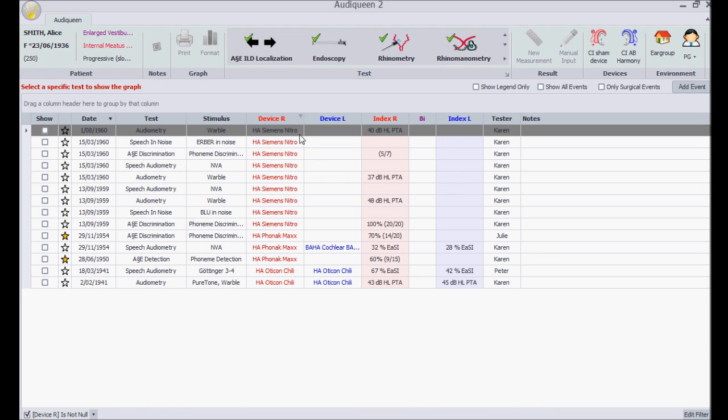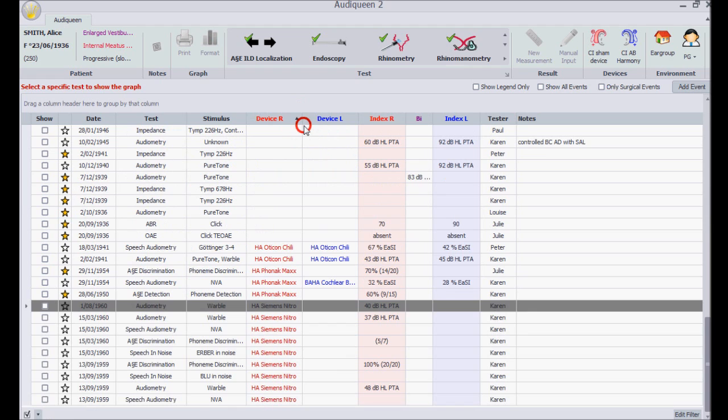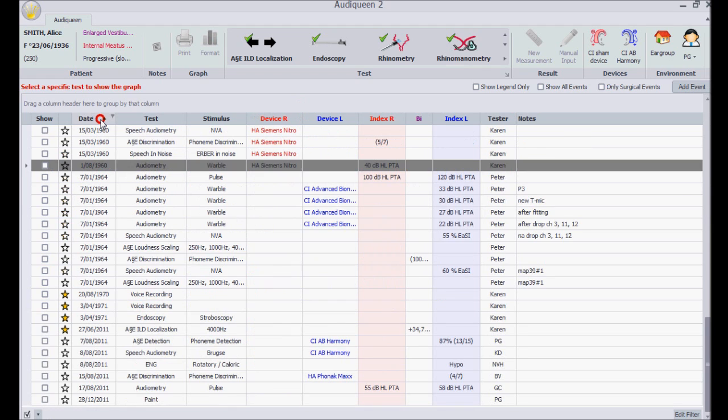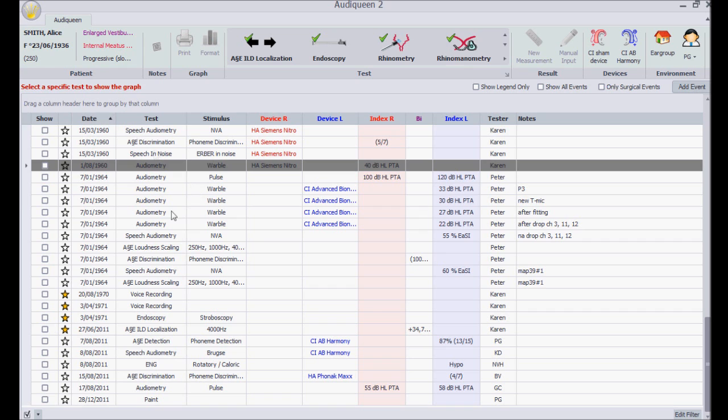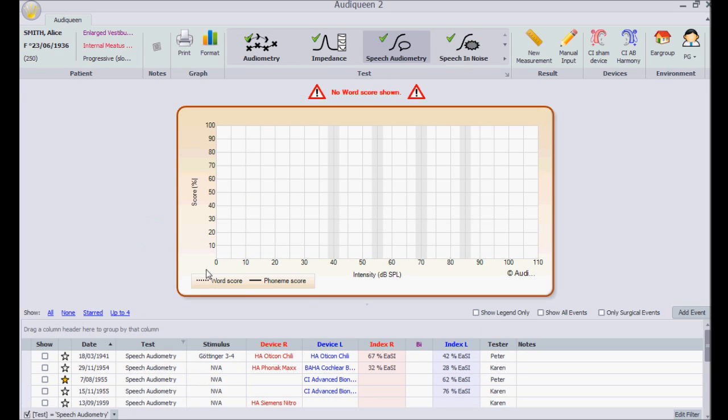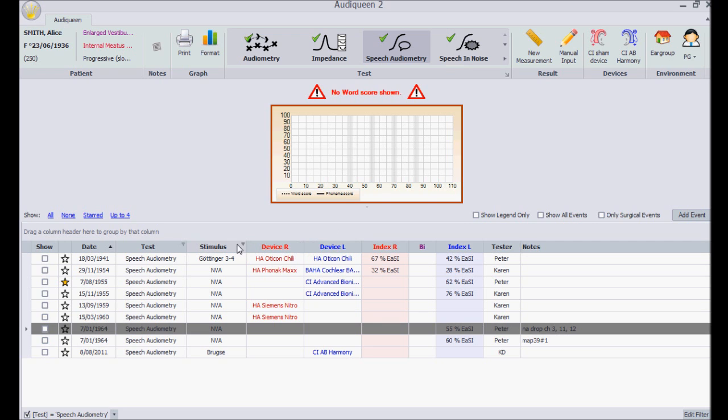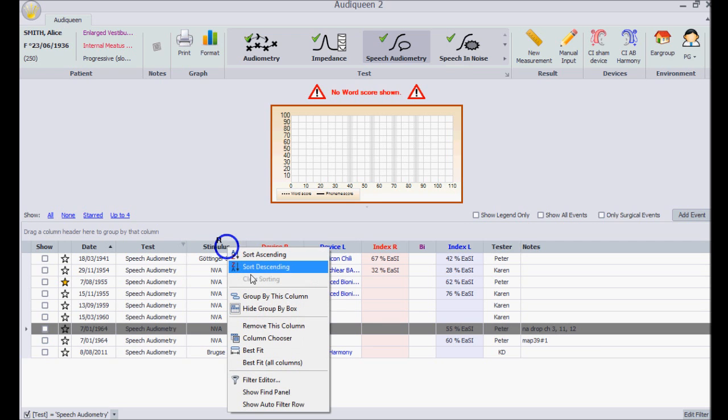Or I can group the results. For instance, suppose I'm interested in all speech audiometric results, grouped per speech list used. Then I first filter on speech audiometry and use the right mouse button to group by this column.